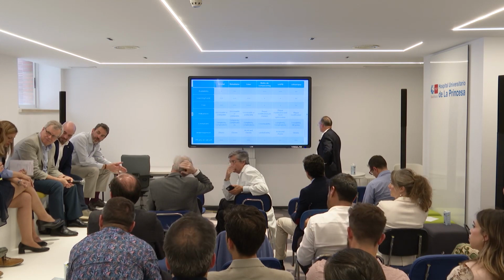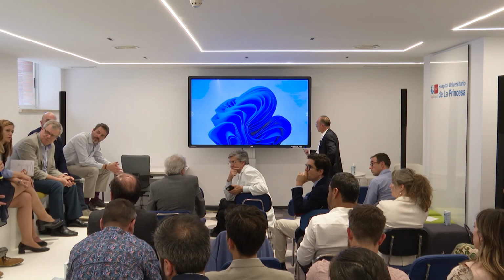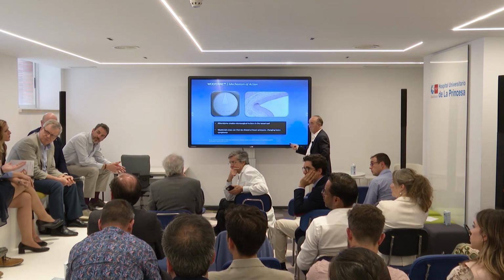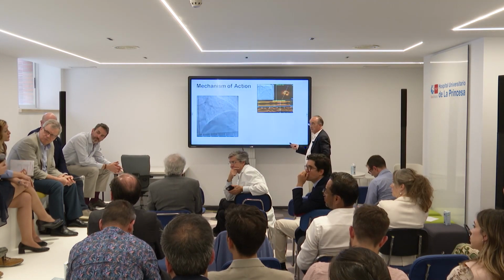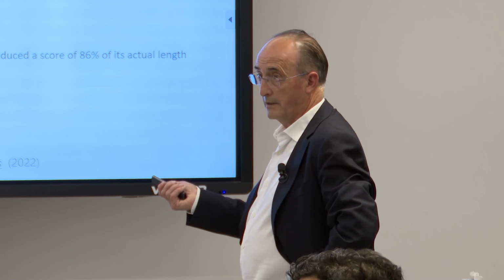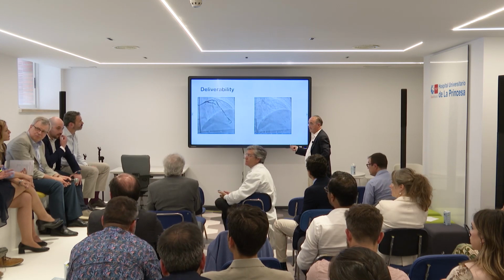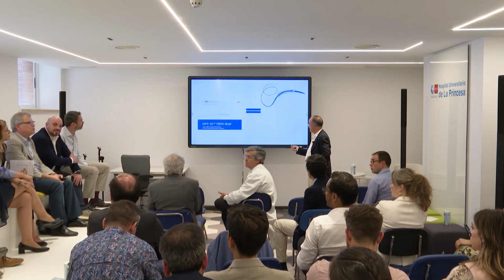Panel, any other comment? Do you have different ideas on this? Yeah, just one brief comment about this. I think maybe the difference is calcium thickness, because I don't agree that you shouldn't use cutting in circumferential, because if you're using it in 180 degrees, what are the chances that you're going to break the calcium? The balloon is always going to go the other way, the soft way. Don't you think so? If it is very thick. No, yes, I mean, probably it's not going to work in very thick, but I also think it's not going to work in 90 degrees or 120 degrees, because it has all the soft tissue on the other side.